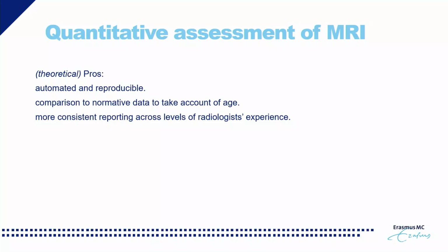But there are real potential benefits of using a quantitative assessment of MRI. It is automated and reproducible, so the software will always create the same numbers. You can take account of age by comparing to normative data, and it could be more consistent across levels of radiologist experience.